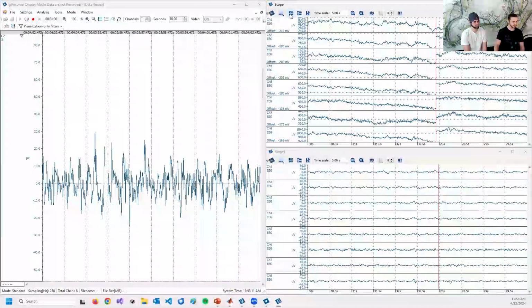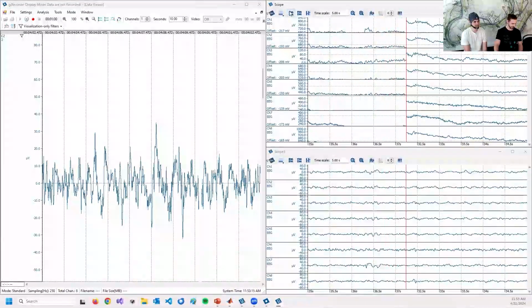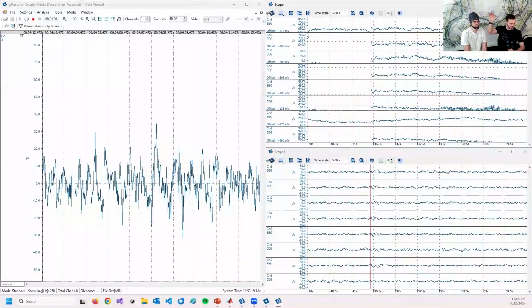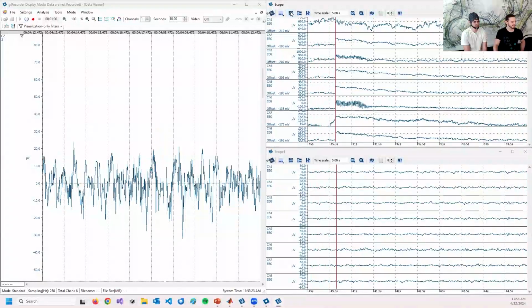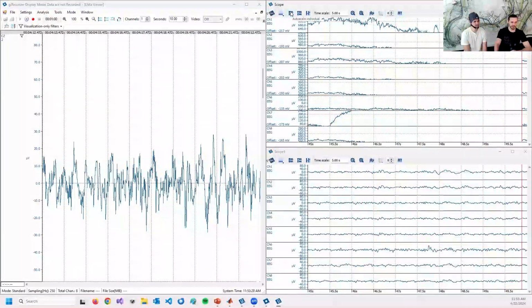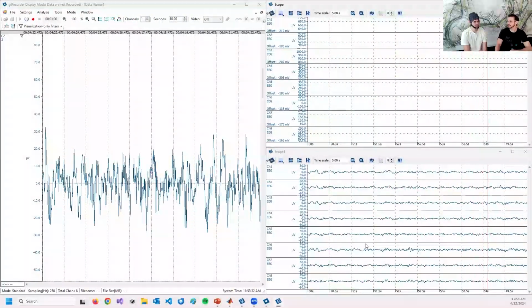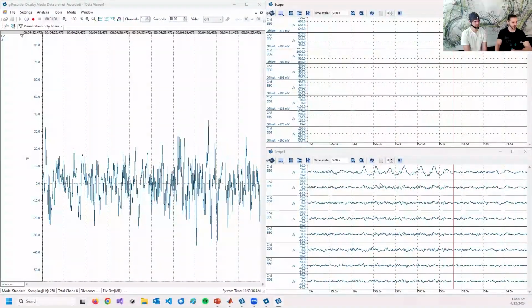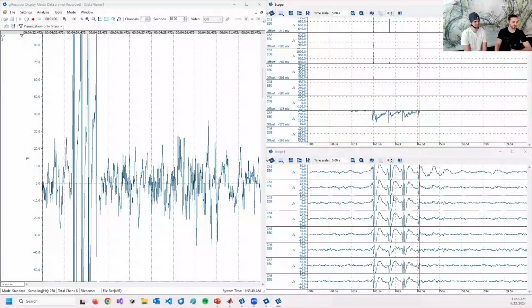So the raw data stream actually looks good, but we can easily disturb it. Like if I'm going close, you can see the frequency band, some noise being introduced, and on the bottom, the signal looks pretty clean. So we can still check if there's still EEG in the signal. So can you blink your eyes a couple of times? You can see some very nice eye blinks. You can clench your teeth a couple of times.